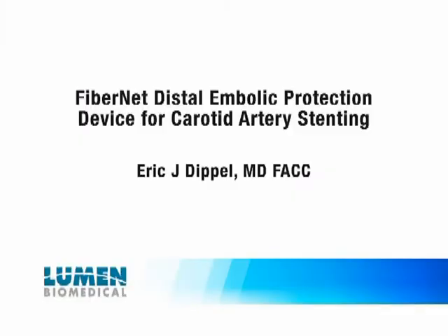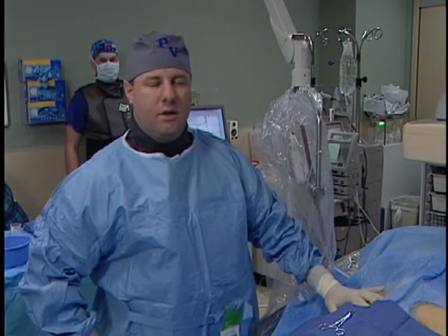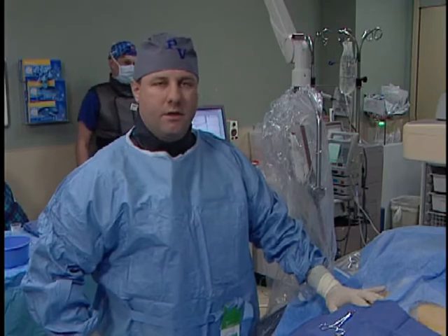Good morning. Today we're at Trinity Terrace Park Hospital in Bettendorf, Iowa. We'll be doing a carotid stenting procedure utilizing the Fibernet Distal Embolic Protection Device.